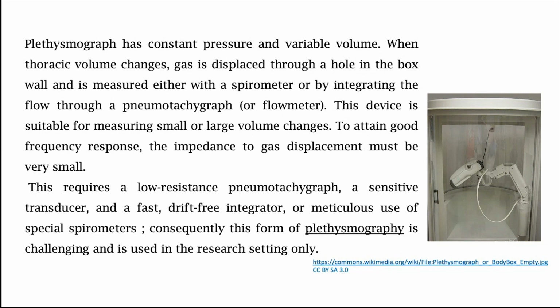Also, the amount of pressure change that you are going to get in a large room is going to be much more minute, essentially affecting the sensitivity of your measurement. So for sensitivity, you need to have minimum volume. But of course, if the volume is too low, then the person will feel claustrophobic, and it's a very scary experience. So it's critical to find the sweet spot where the person is not feeling very scared, but at the same time we are able to get accurate measurements.